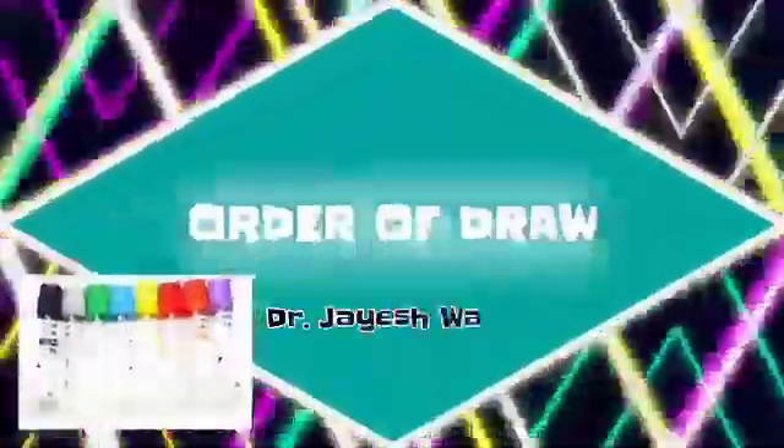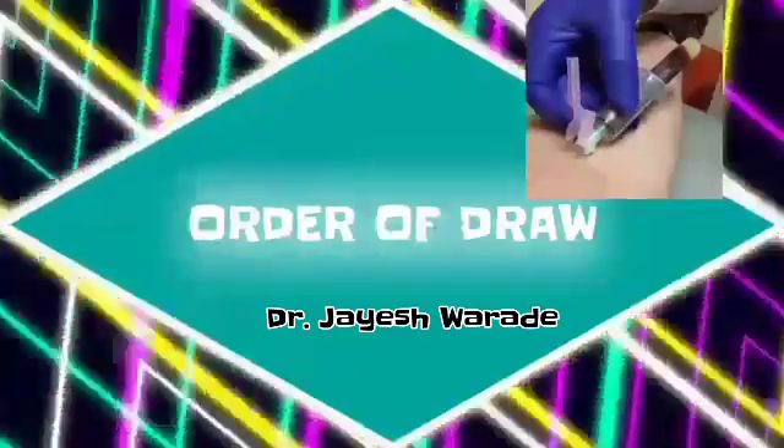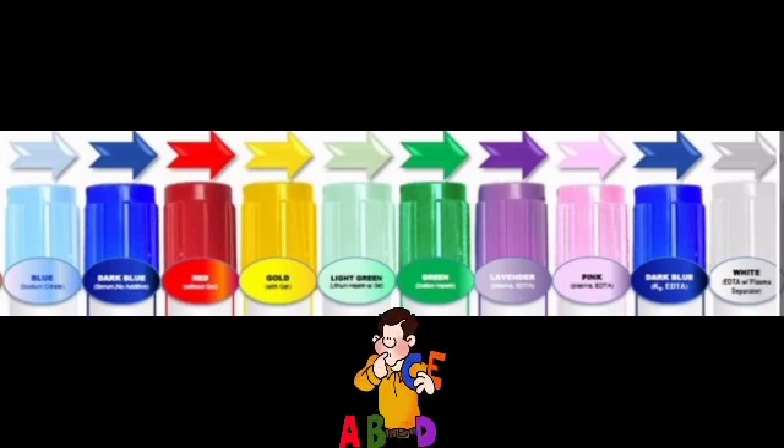In this video we will see about the correct order of draw while collecting multiple tubes during single venipuncture. There are different types of blood collection tubes with different color code caps, and they are to be collected in a specific sequence while doing a blood collection.